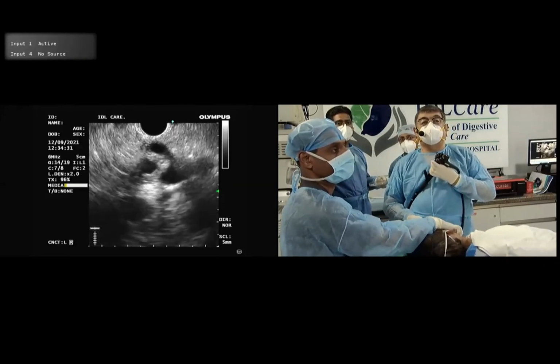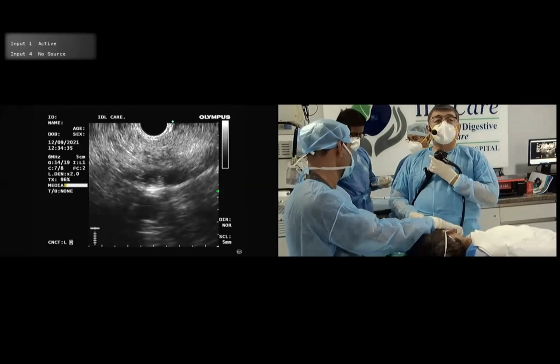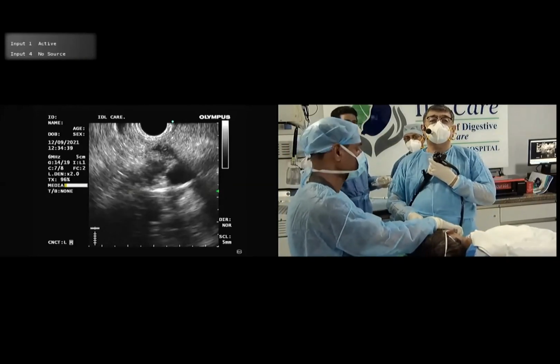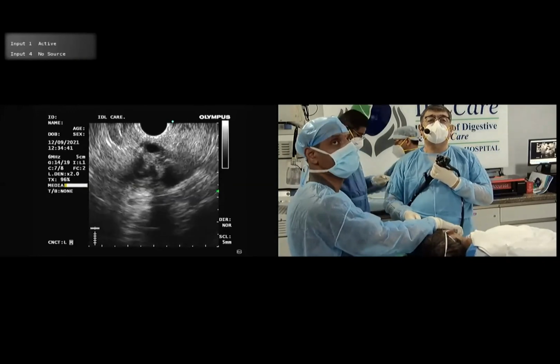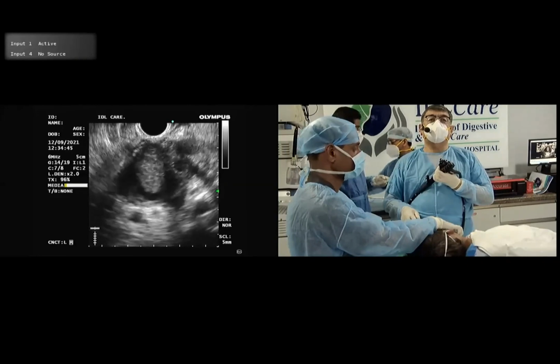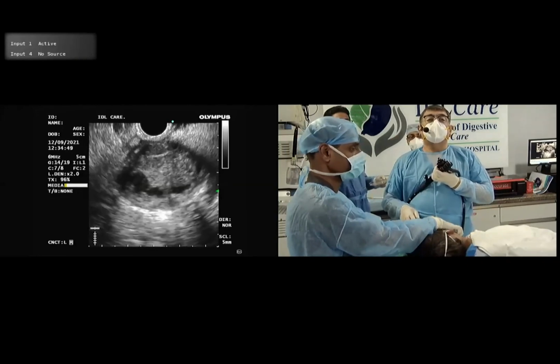Have we got something good? So in the last 2 years, I have never made a second pass. A single pass doing like this gives me enough material. Yesterday also you saw both Jahangir and Rajesh got good material in the first pass.